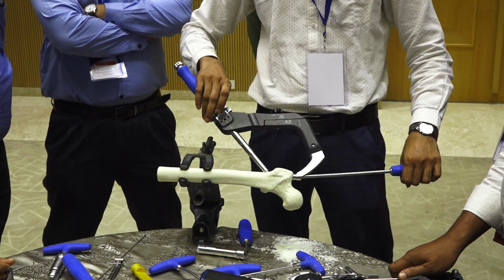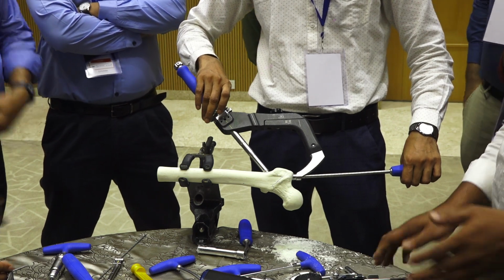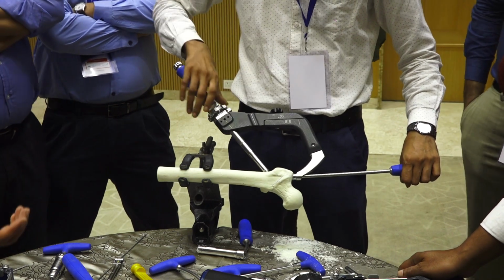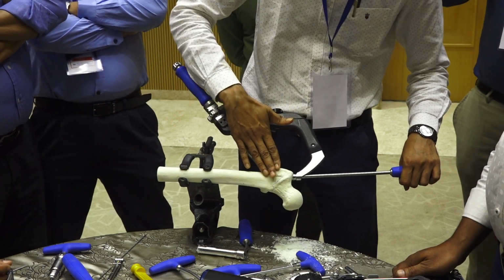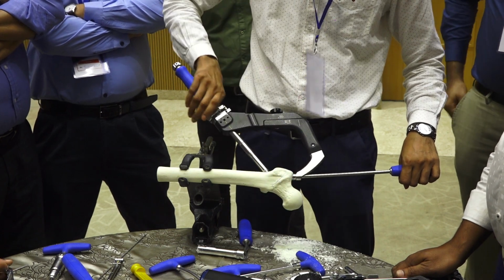Maximum compression is 13 mm. 8 mm. 8 mm. So we have to check it. We have to give clockwise rotation, so this nail area will get compressed. The fracture will compress.